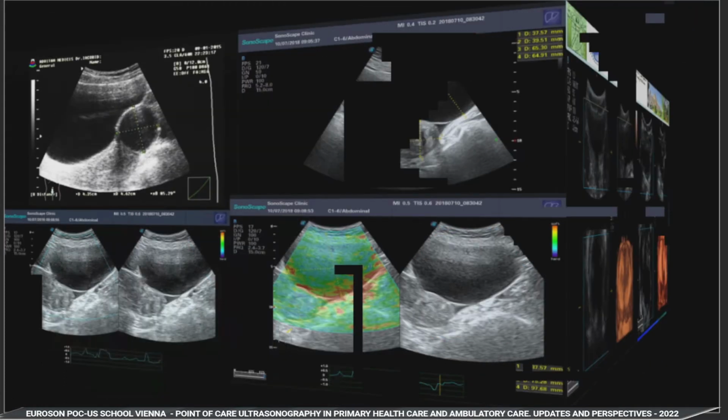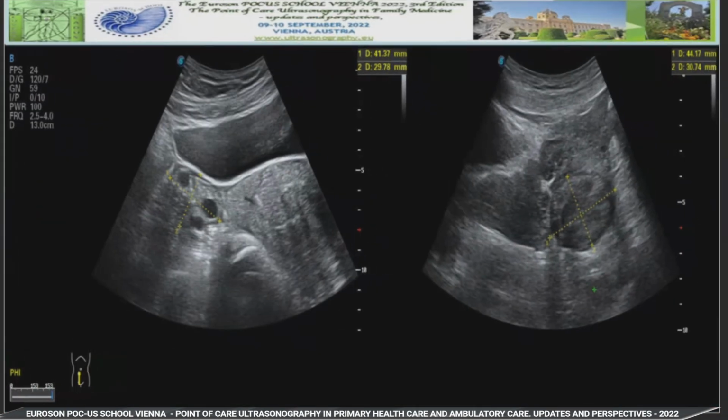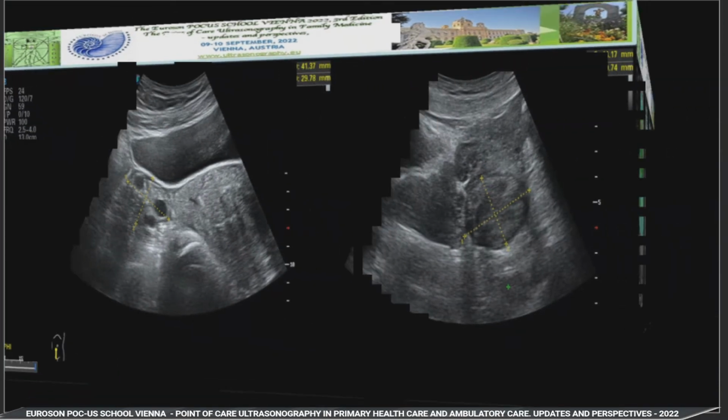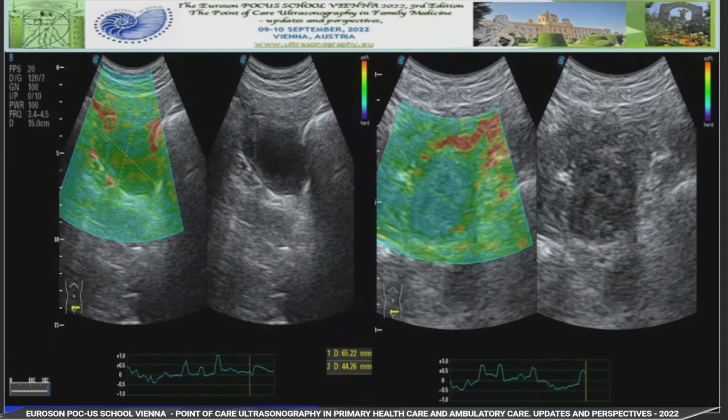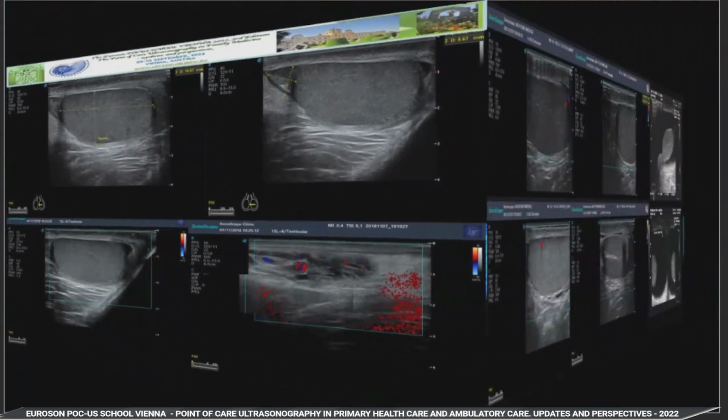and this is the prostate. And also you can find the ovarian tumor of the woman, this ovarian adenocarcinoma with the hard stiffness of these tumors. And also you can examine the testes.